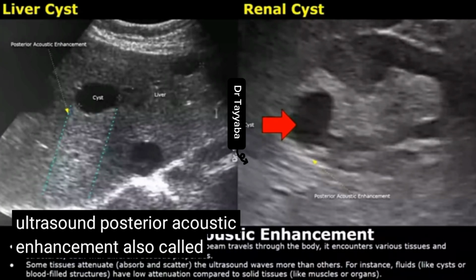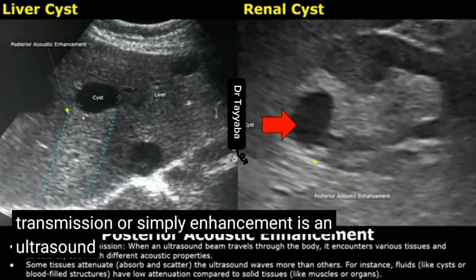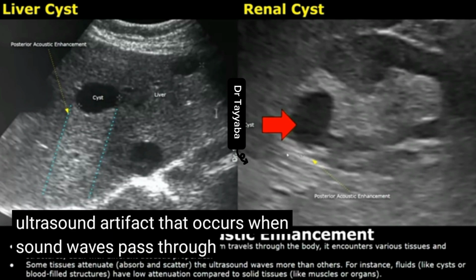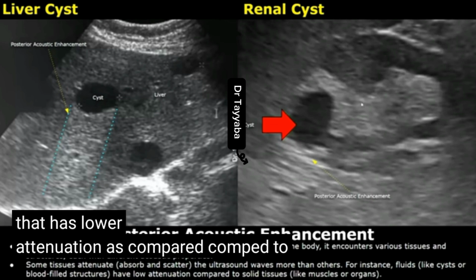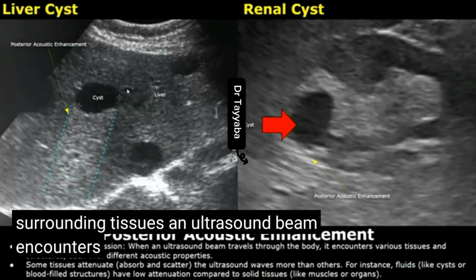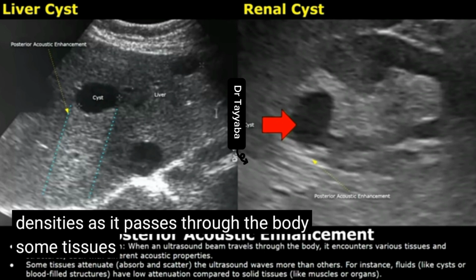Posterior acoustic enhancement, also called through transmission or simply enhancement, is an ultrasound artifact that occurs when sound waves pass through a structure that has lower attenuation as compared to the surrounding tissues. An ultrasound beam encounters various tissues of different densities as it passes through the body.